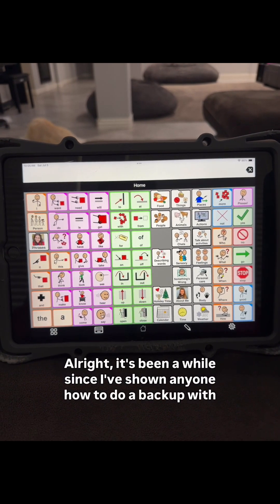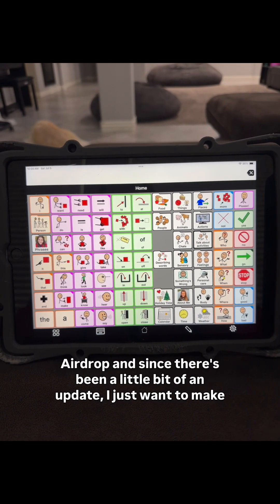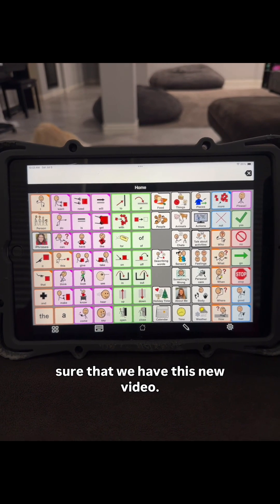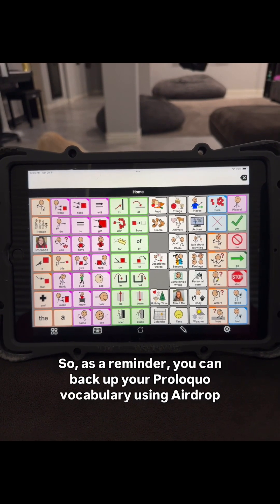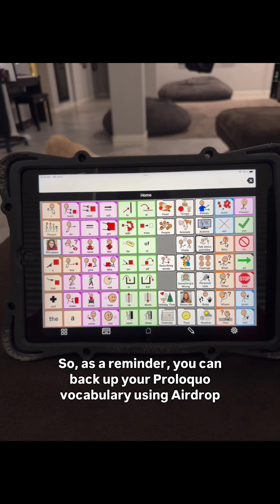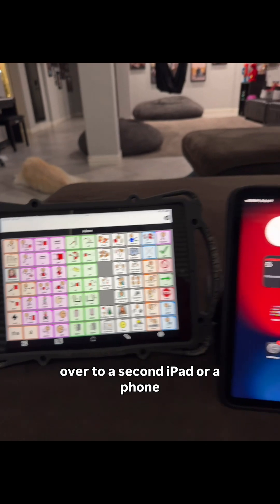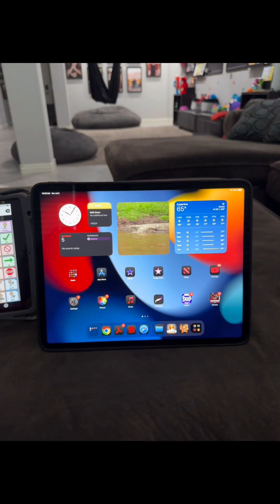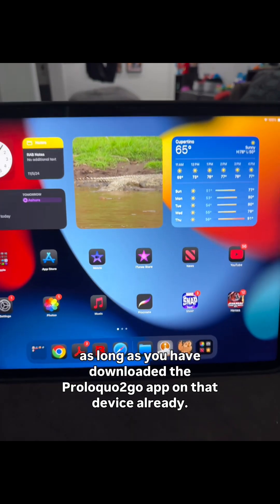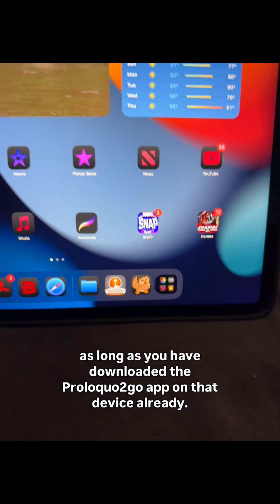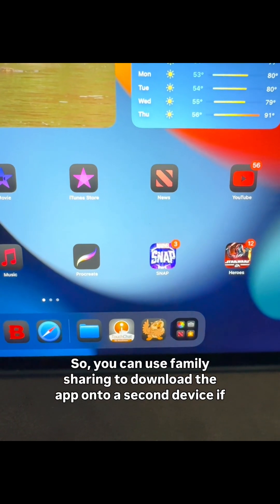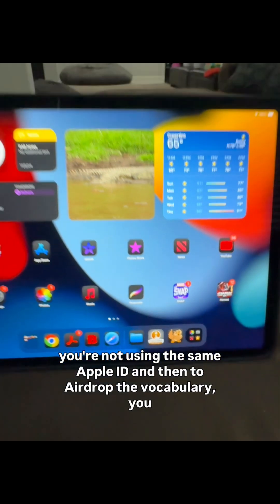It's been a while since I've shown anyone how to do a backup with AirDrop, and since there's been a little bit of an update, I just want to make sure that we have this new video. As a reminder, you can backup your Proloquo2Go vocabulary using AirDrop over to a second iPad or a phone, as long as you have downloaded the Proloquo2Go app on that device already. You can use Family Sharing to download the app onto a second device if you're not using the same Apple ID.